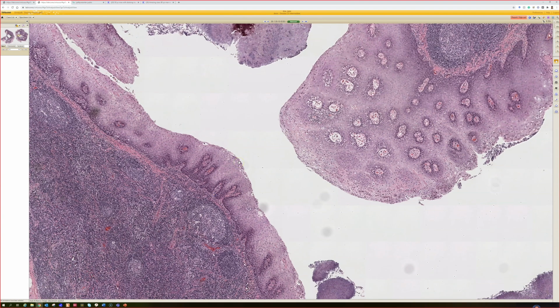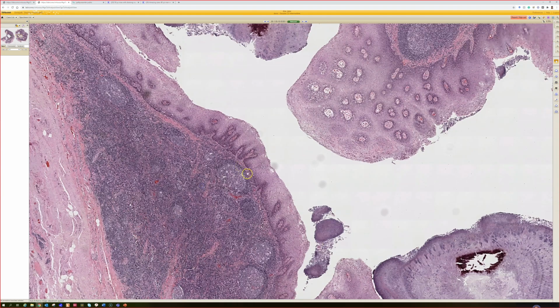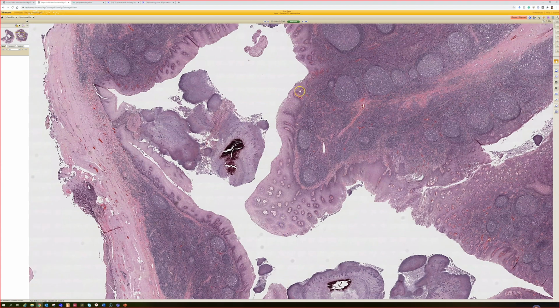And I know this is not fair because it's not skin, but do any of you know? Could it be a tonsil? It's a tonsil. Very good. That's the way I learned it as a resident. A tonsil is like a lymph node, but covered with or having some invaginated structures. These are actually crypts. See, this is not the outer surface here. These are invaginated cystic spaces lined by squamous mucosa. So those are the crypts, the infolding of the tonsils.